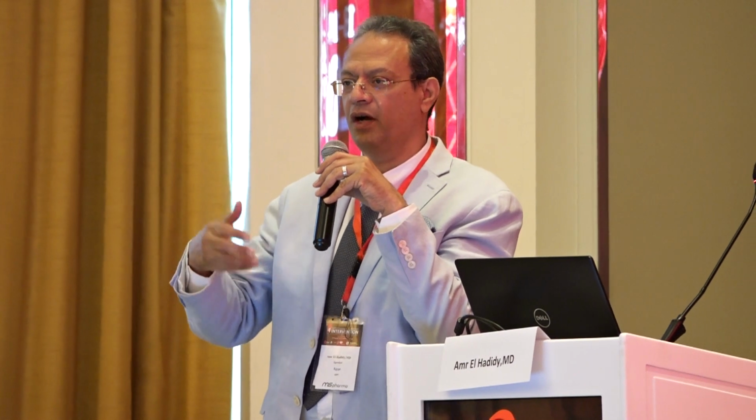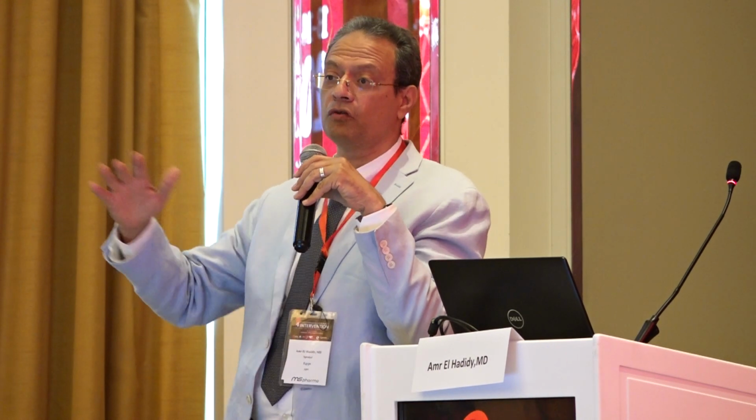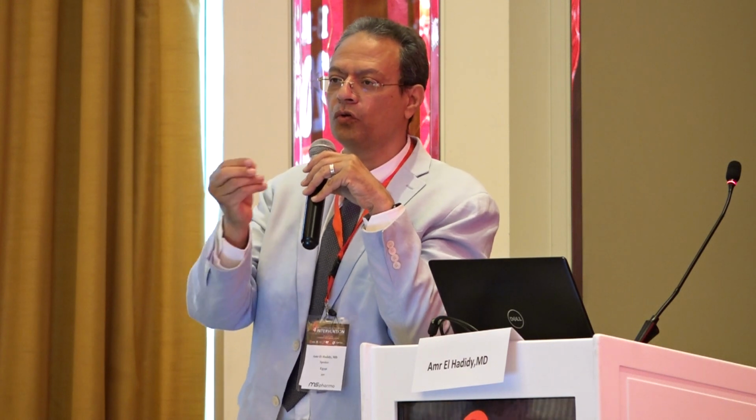The most important point is you need to have some experience. If you go antegrade first, you need some wires, and you can definitely try to stick to one of your favorite wires. If you like to go with a Gaia, for example, or a Fielder XT, you need to master these wires, because if you are not using the wire properly, you will have a lot of cost, because you cannot cross, so you remove it, and then another wire, so the cost will be very high. So you need to choose 1 or 2 or 3 wires to be favorable for you in these cases. Another thing is the microcatheters.